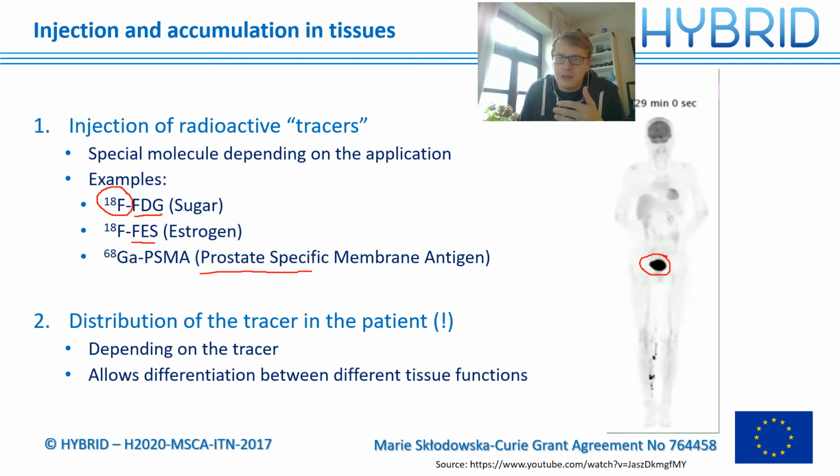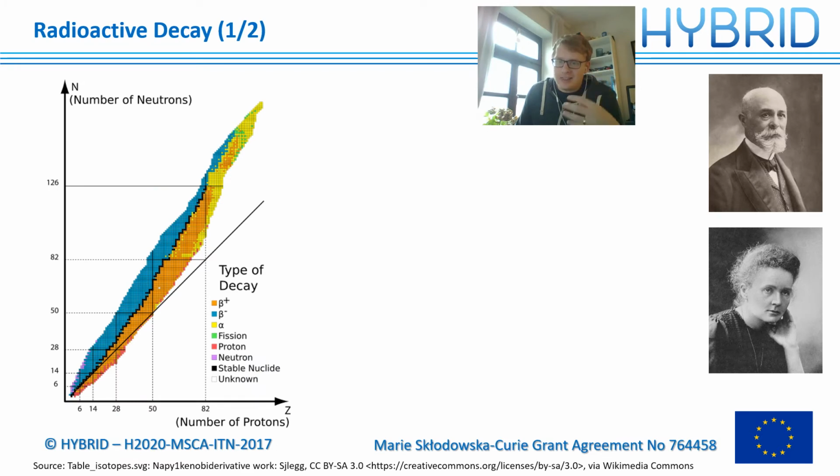And you can also see the brain has got a really high activity because this is an FDG scan actually, and the brain is just using a lot of energy. And yeah, I think that's a really interesting video. And let's start with the basics.